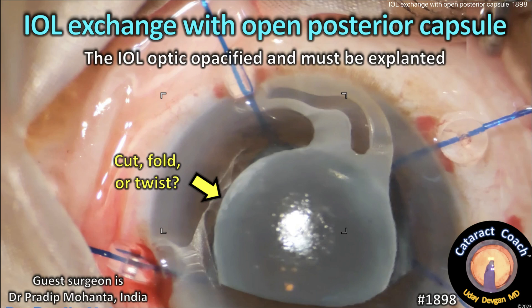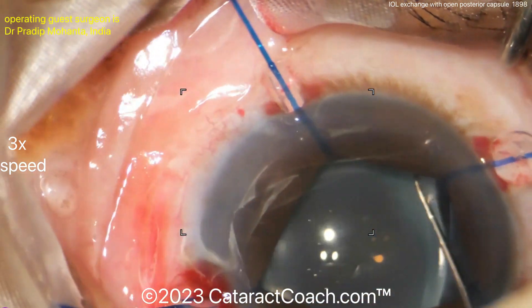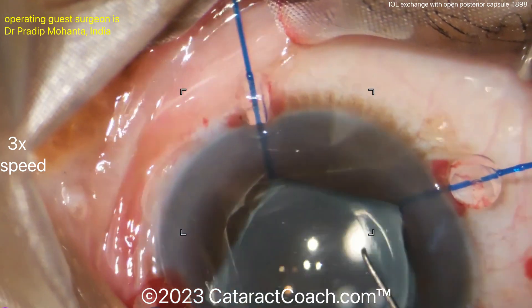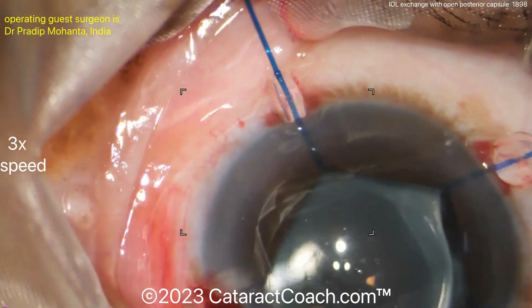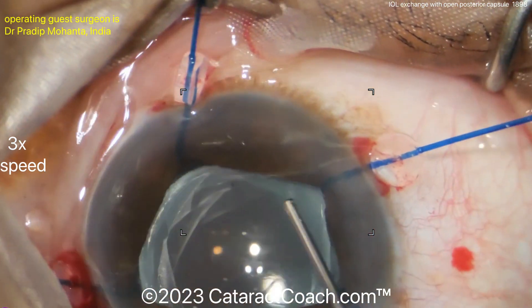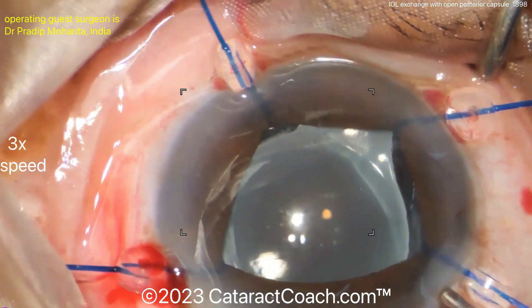IOL exchange with an open posterior capsule — this IOL optic has opacified and must be explanted. You can see small pupil iris hooks being used to expand the pupil. A Sinskey hook is used to get under the rhexis edge to try to free up the lens, or at least get the capsule off the optic. Then a dispersive viscoelastic is used to perform a visco-dissection — a key step to help free up that lens.